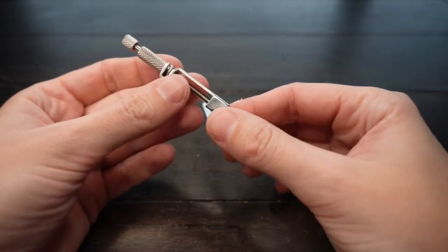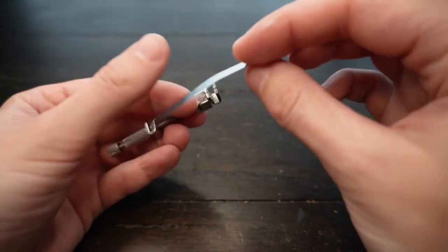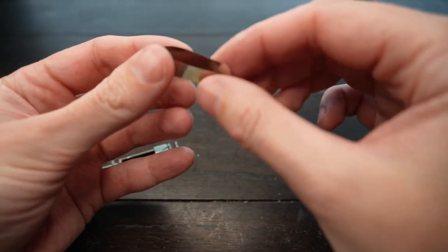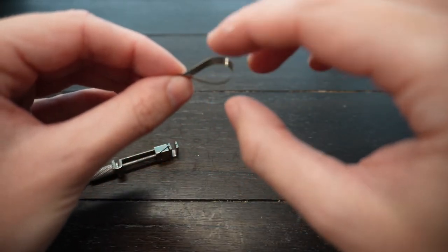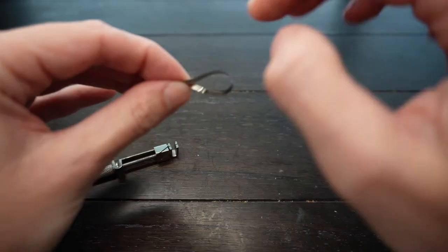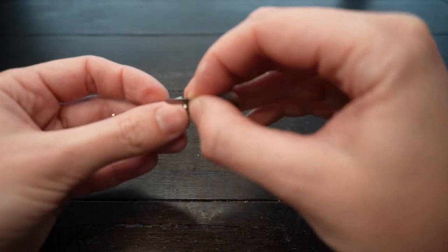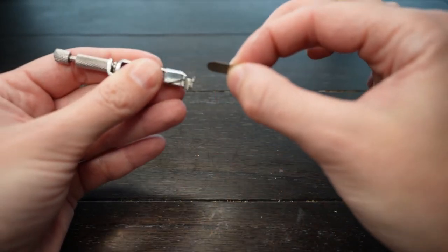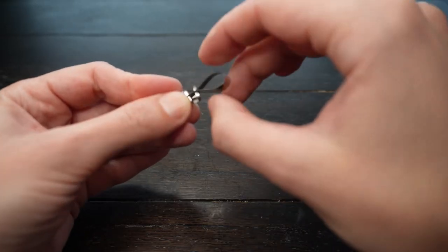Hello everyone, I wanted to show you how to use Tofflemire with a matrix band. First you need to fold your matrix band. When you fold it, you make sure the larger aperture goes down and the smaller one, this is the smaller one, looks up. Then you place your Tofflemire with the slot up and you insert the matrix band in the Tofflemire.